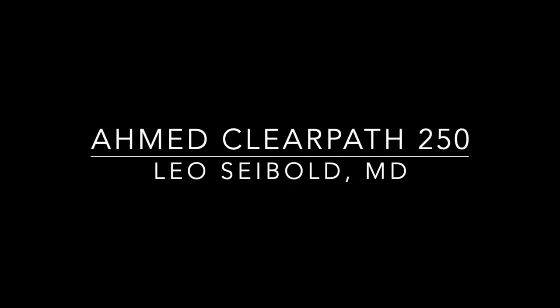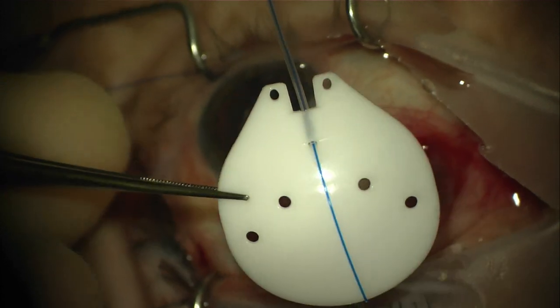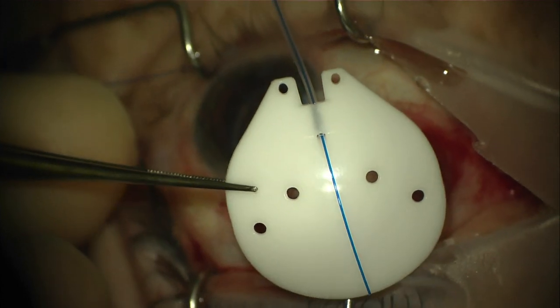This is the surgical technique for the new AMED ClearPath Glaucoma Drainage Device. In contrast to the AMED Glaucoma Valve, the AMED ClearPath is a non-valved tube shunt device.